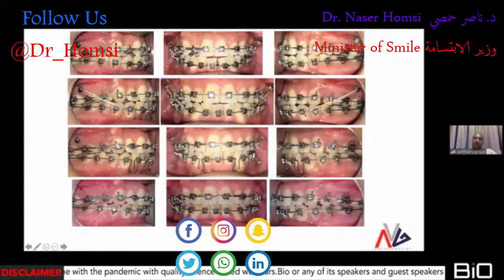And finally, I used some indirect anchorage, got it back. I used anchorage from the upper screws onto the lower canines in order to get them back as well. And finally, when I was still not able to control the inclination, I went into round wires with some closing loops to give some differential moments over there to tip the teeth back. And finally, I was in a position to get a decent inclination of the upper and lower incisors.